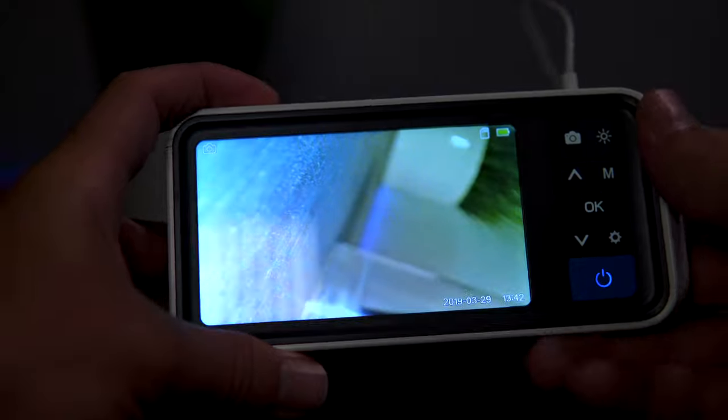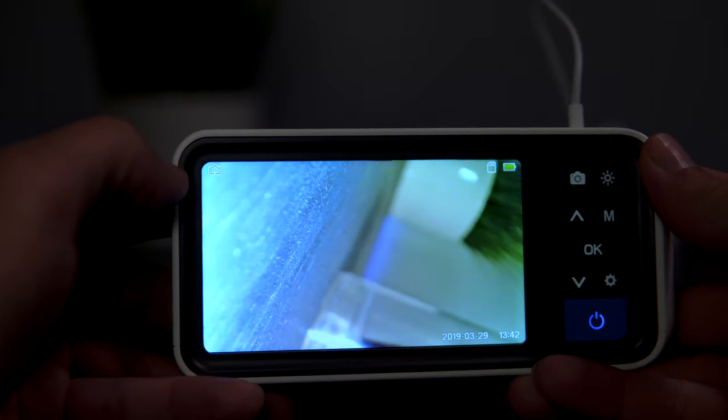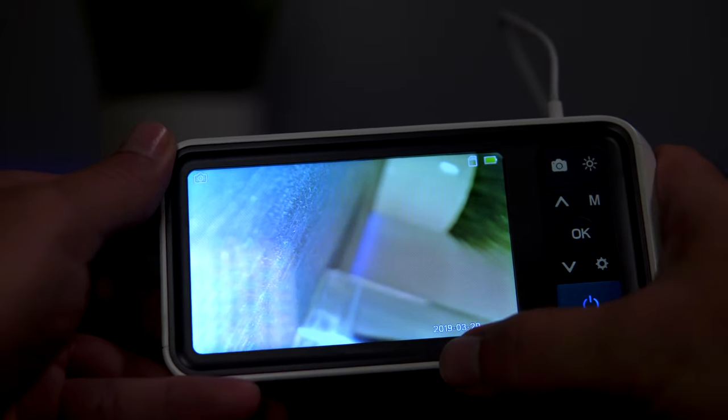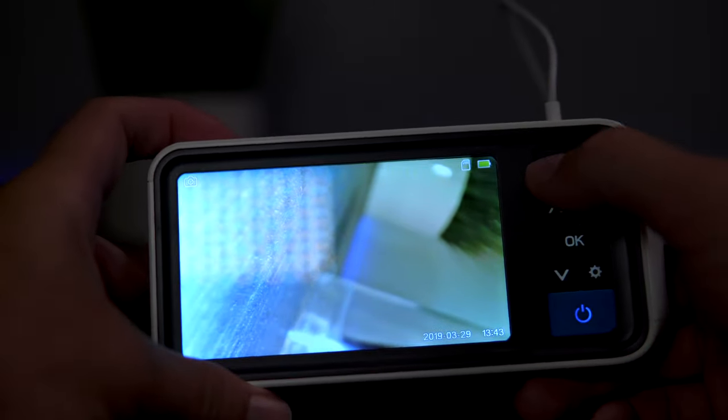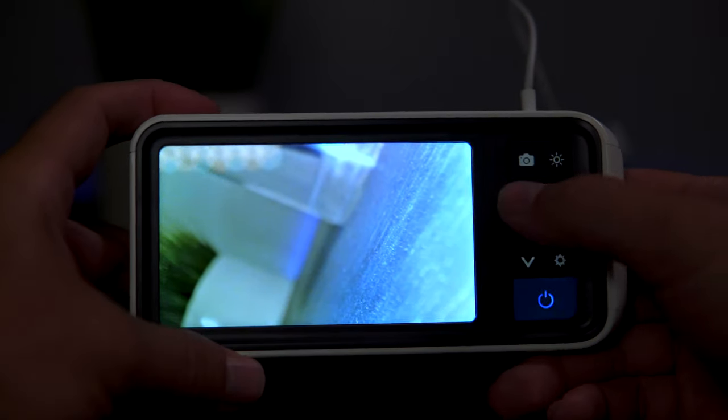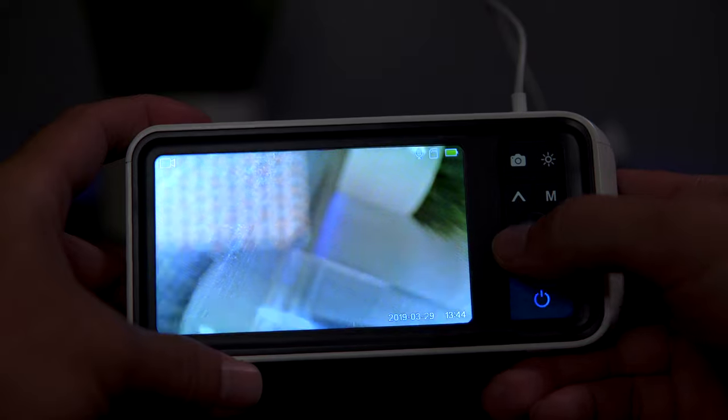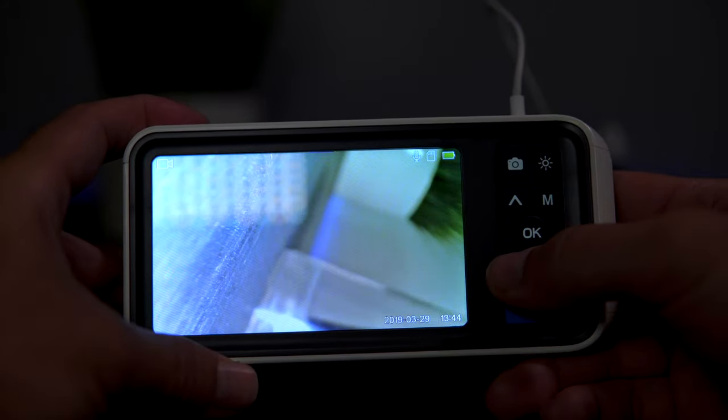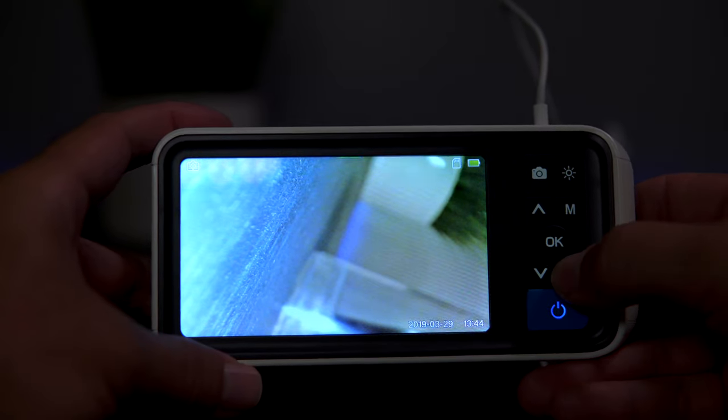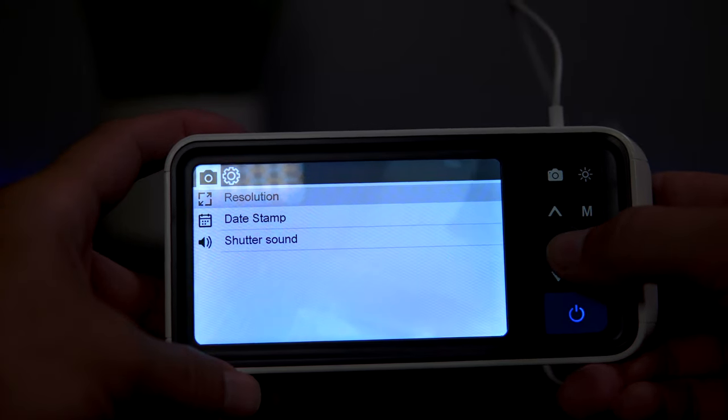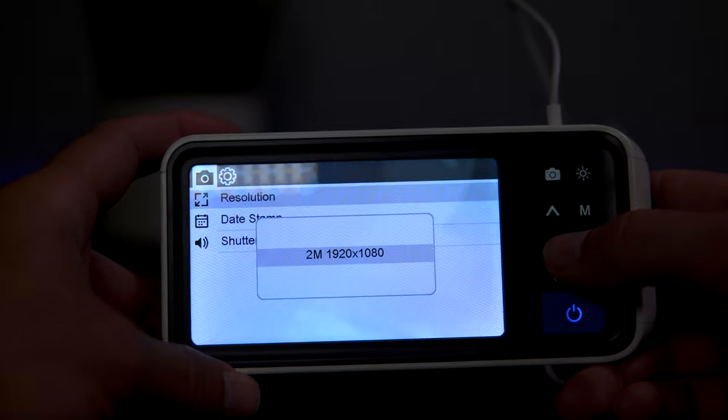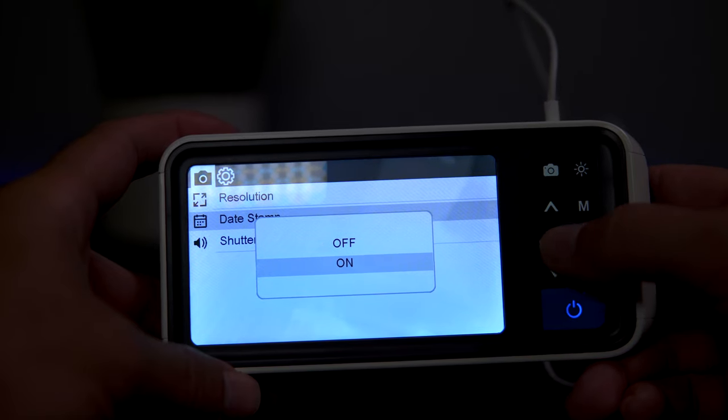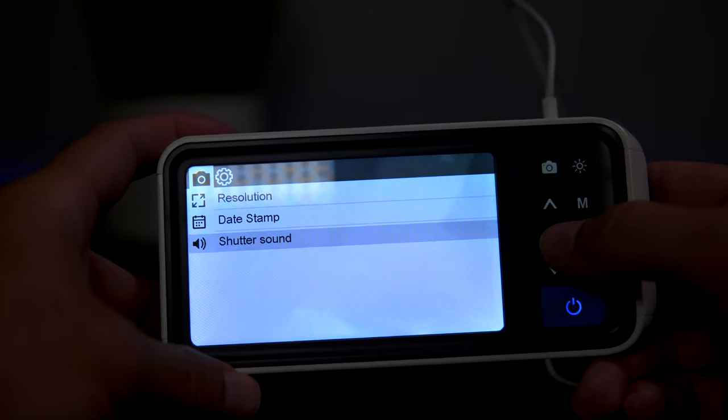On the screen here we can see we're in photo mode, shown by the icon in the corner. We have our micro SD card, battery life, date, and time. If we click this photo button, we take a picture. While in camera mode, if we click these up and down buttons, we can rotate the image, which could be quite useful. This is our enter button. Let's go to the settings. We can choose the resolution—it's set to 1080. We can turn the date stamp on and off, and the shutter sound.